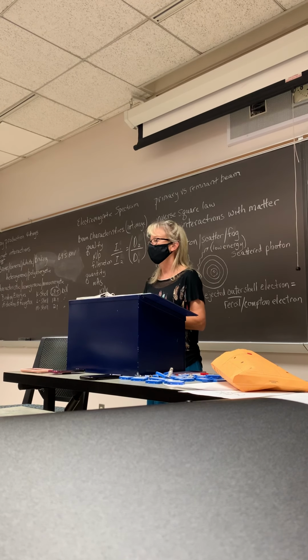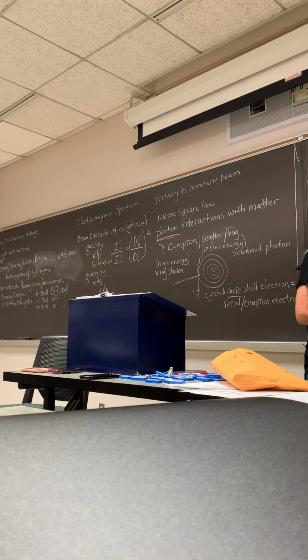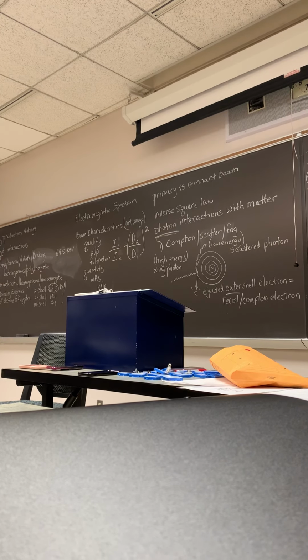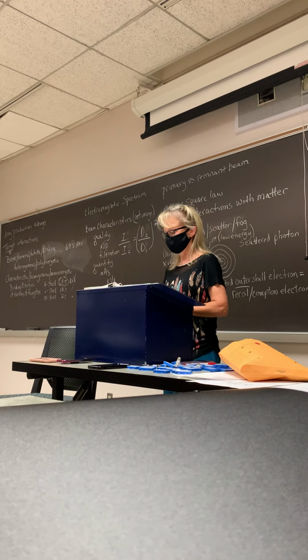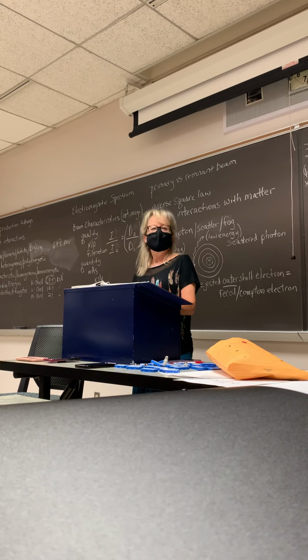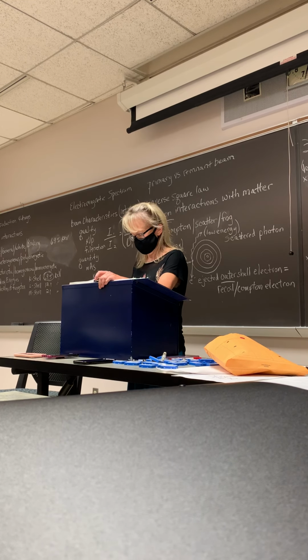They don't help the image, and they're bad for the patient's skin dose. They don't have enough penetrating power to go anywhere, so they add to patient skin dose. That's why they have filtration. The more filtration, the higher the quality of the beam, because you're getting rid of those non-useful photons.